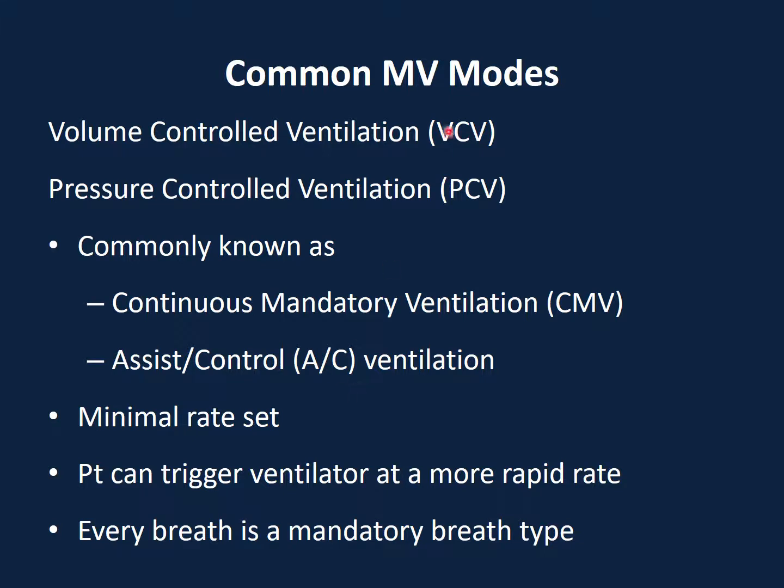For these modes, a minimum rate is set, and even though a rate is set, the patient can breathe more than the set rate. Therefore, the patient can trigger the breath. However, even when the patient is triggering the breath, every breath on these modes is a mandatory breath, or machine breath.